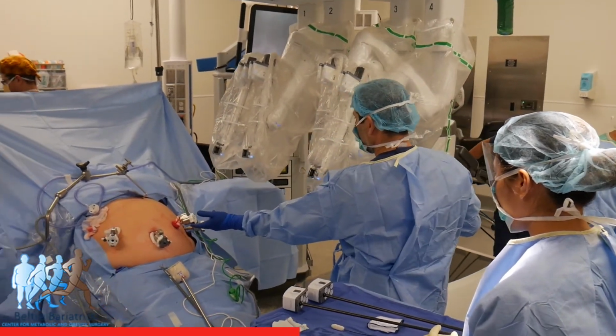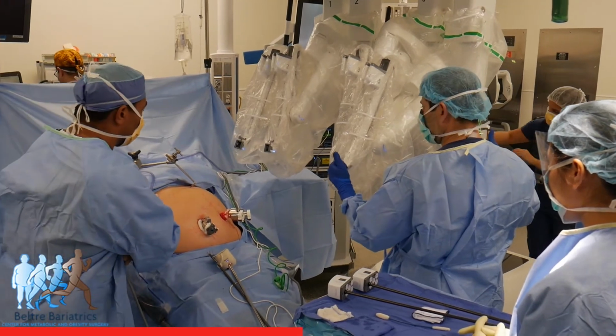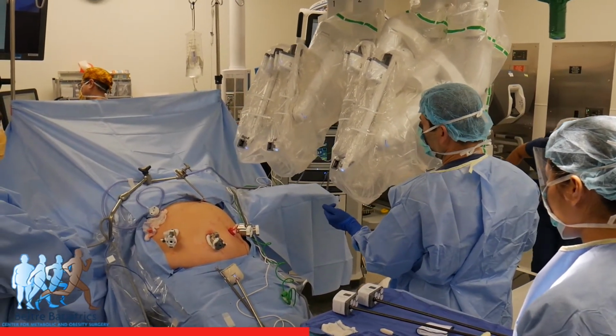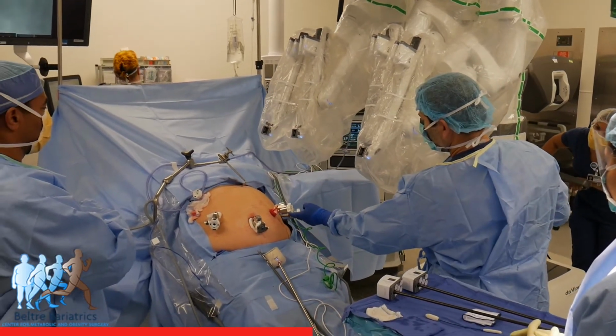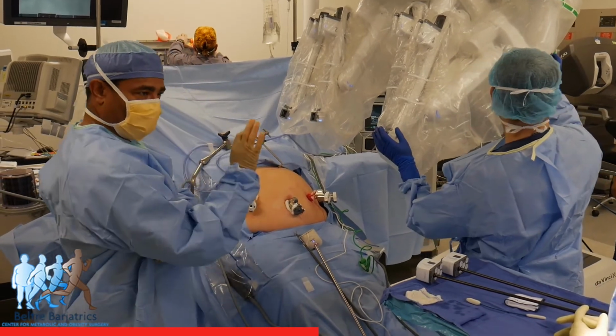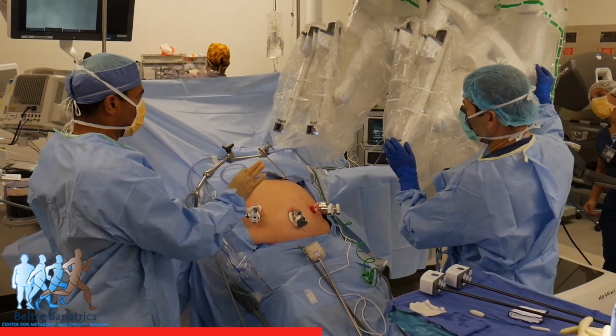Ahora lo vamos a traer por encima del paciente. We're going to bring the robot over the patient, kind of turn it around and position it, and then connect those arms to the port. So there is us turning the robot around.